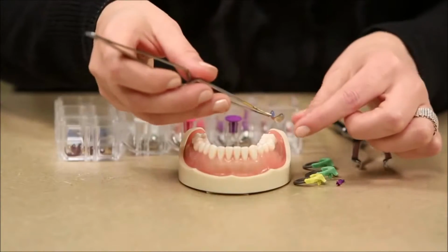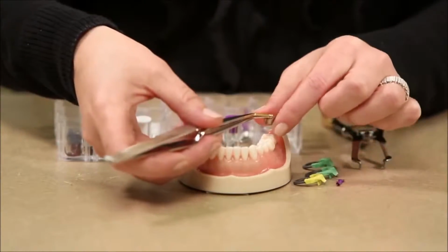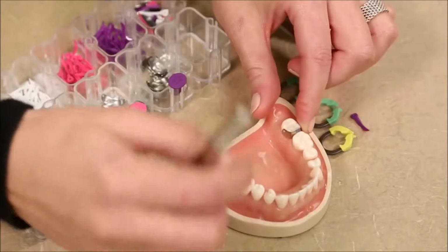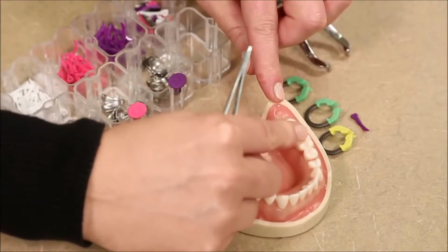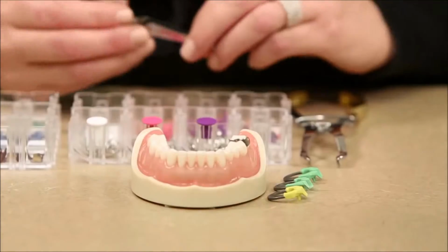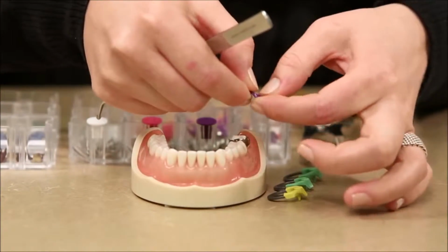Before I place this, I'm going to bend it at a right angle and then place this into the prep. Then I'm just going to bend that tab toward the adjacent tooth, and it's going to become a little handle while I place my wedge. Alright, so next I'm going to place the wedge.